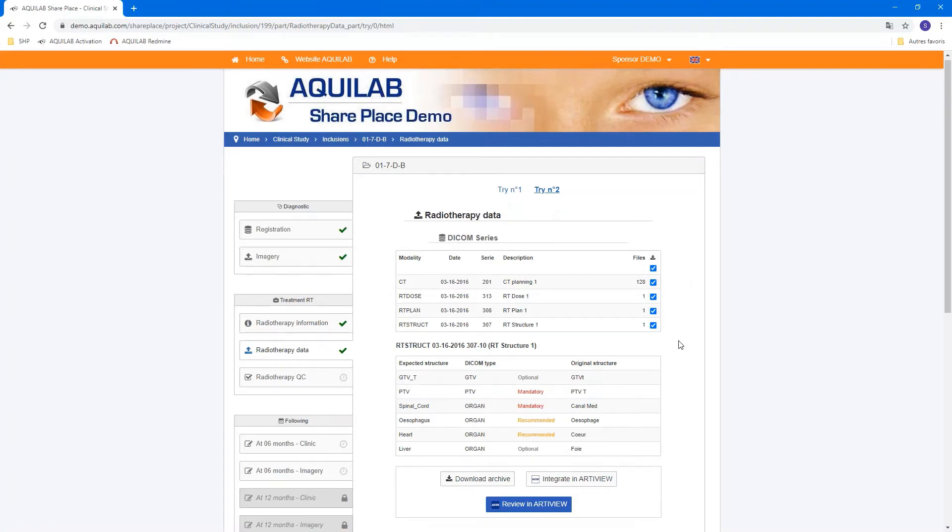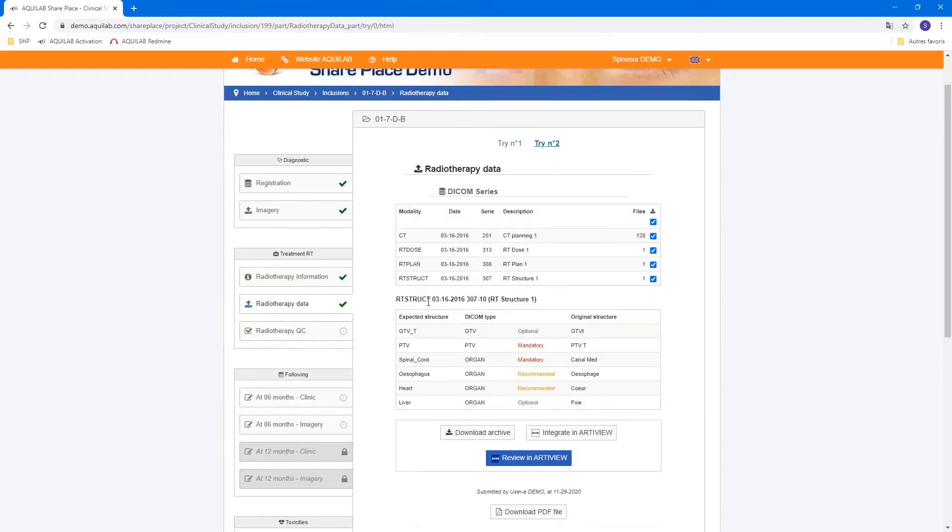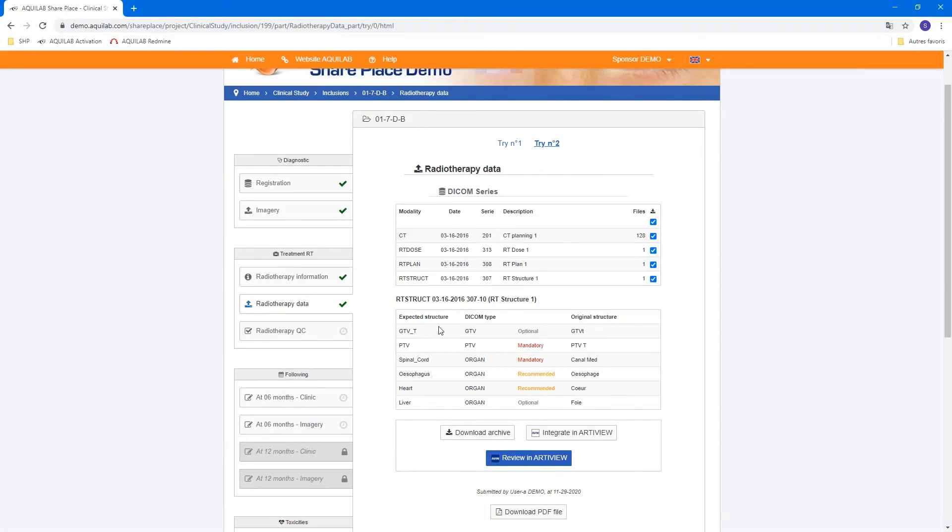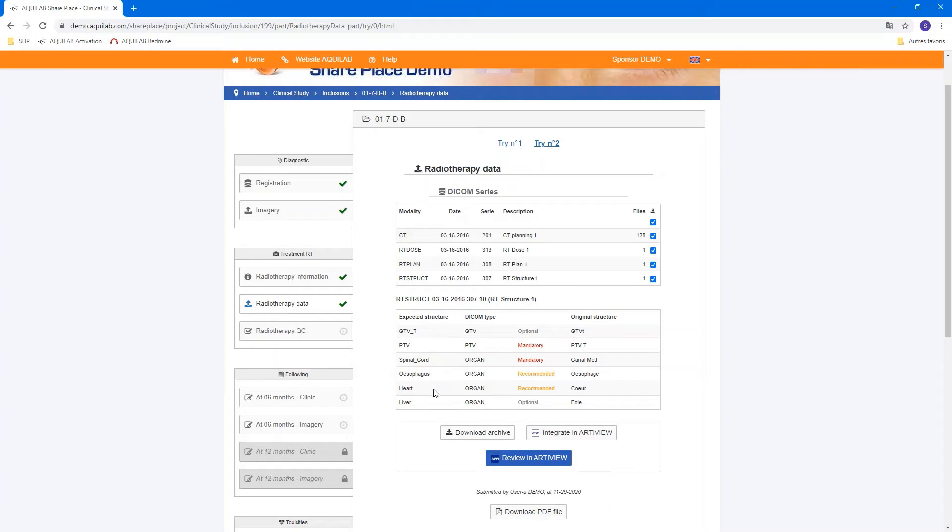And they can harmonize all the structure present in the original RT struct to the expected structure that is defined by the platform. This structure can be customized by the protocol. And you can see here you have for all the patients in the platform, the GTVT, PTV, spinal cord or heart, for example.